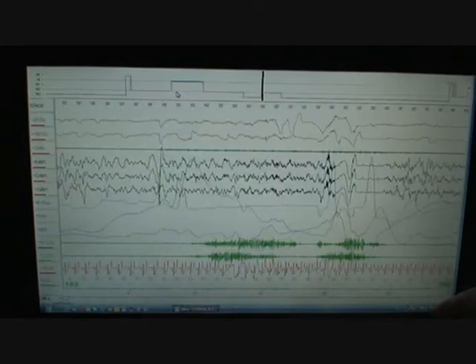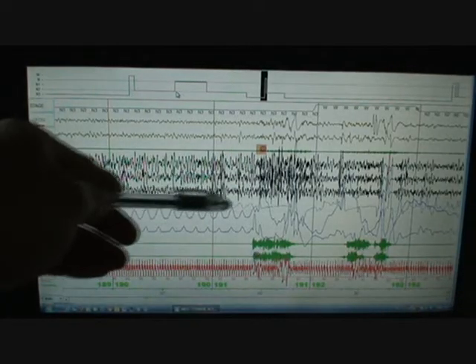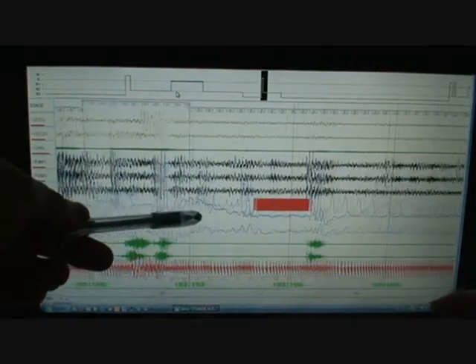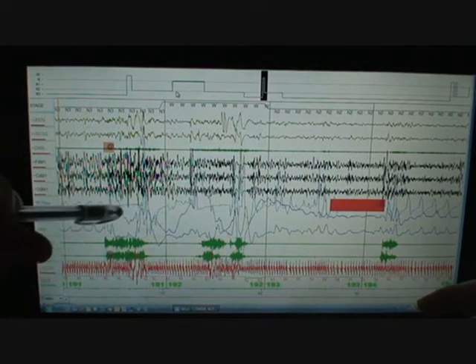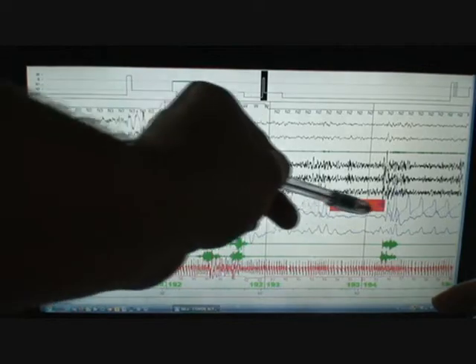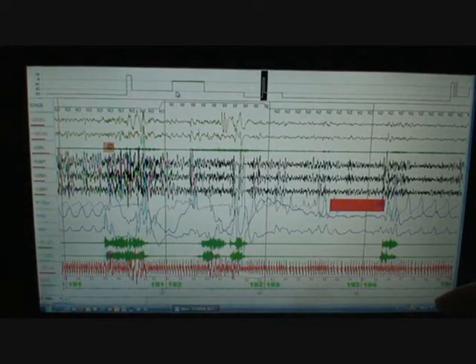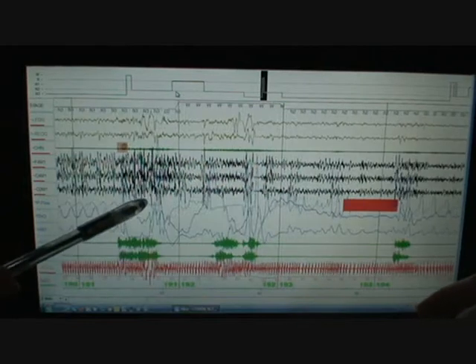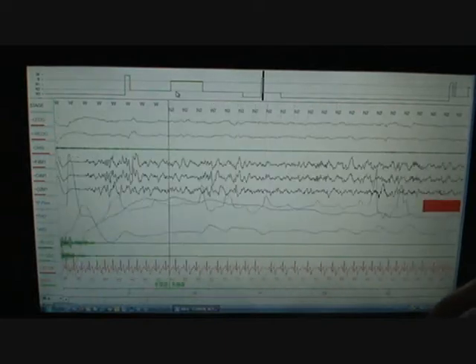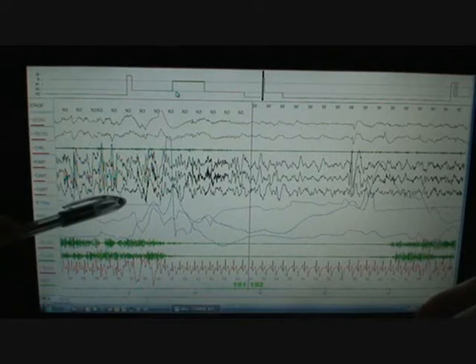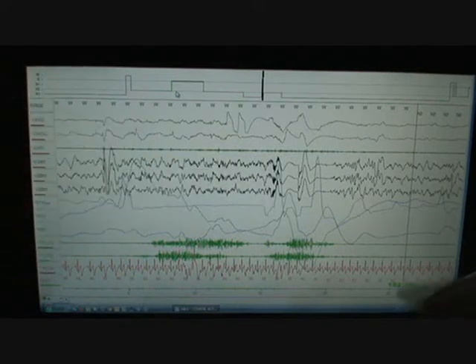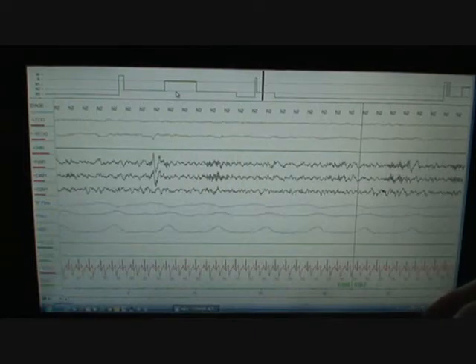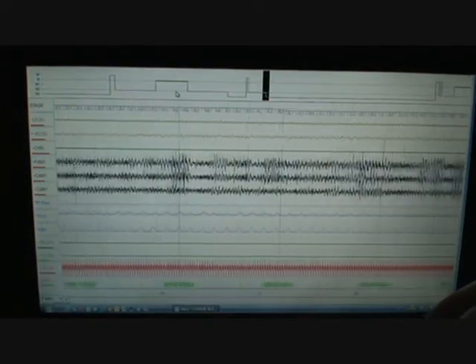This is also an interesting point right here. You can see the person wakes up, has a pretty big awakening. So they wake up and right there, you can see that they have some breathing abnormalities. So this looks like an apnea. It's not. You can see that's extremely thick right in there. It looks like they stopped breathing right here as well. Well, they're completely awake there. Here's something that looks like it would be a RERA, except that they're awake during that part of it. And then here they're asleep and they do have a RERA, which is counted. With a data capable machine though, it's going to count all of this stuff as something. So right here, you can see they're clearly awake and it's flat. It looks like an apnea. Again here, awake, it looks like an apnea. It can't be an apnea because they're not asleep.